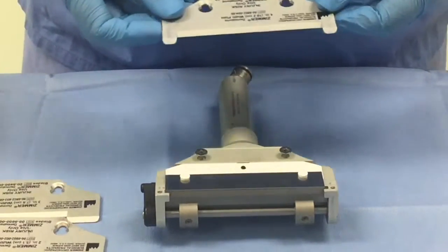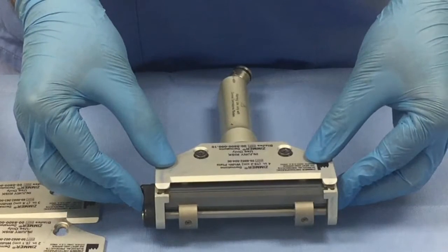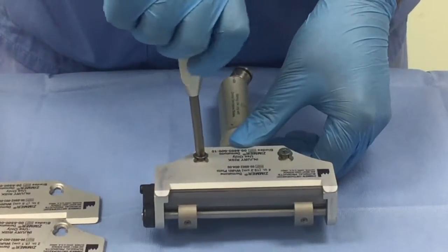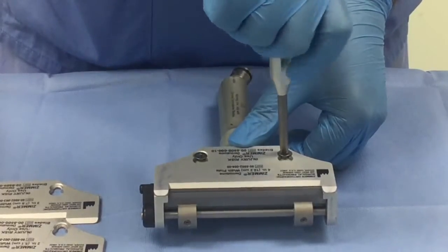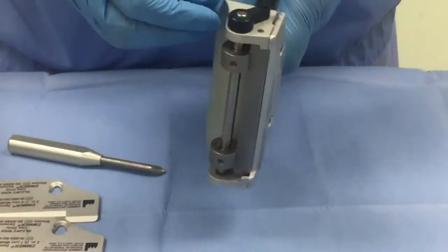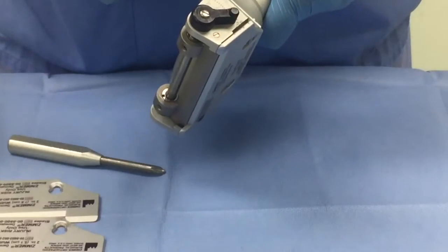To secure the base plate, slide the screws through the larger holes of the base plate and then slide the whole plate forward until you hear a click. Then tighten the screws to secure the mechanism. Once you have tightened it, make sure it is secure by moving the plate around. At this stage, also calibrate the thickness of your skin graft, which is usually between 6 and 8 thousandths of an inch.